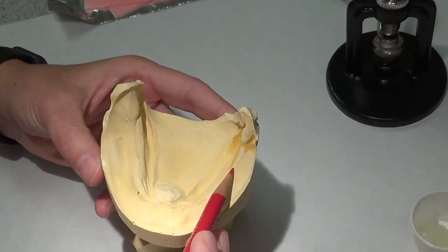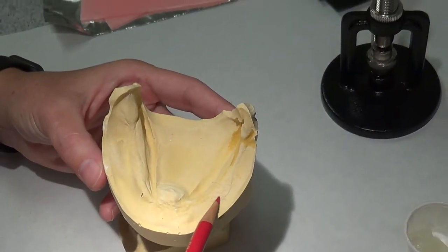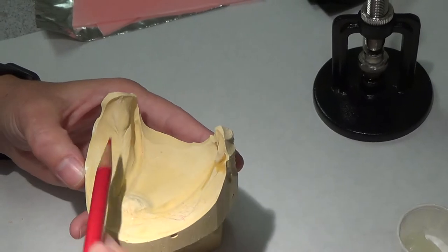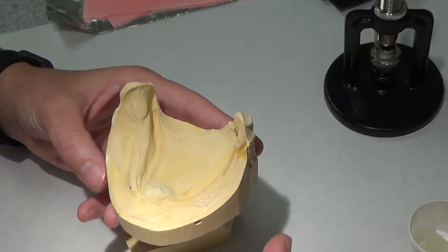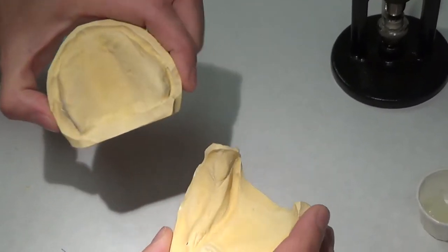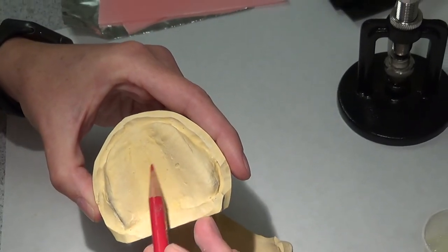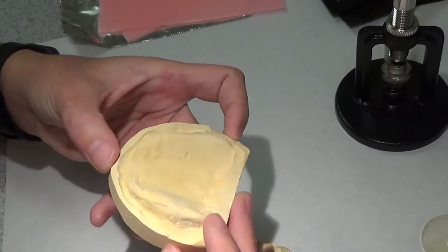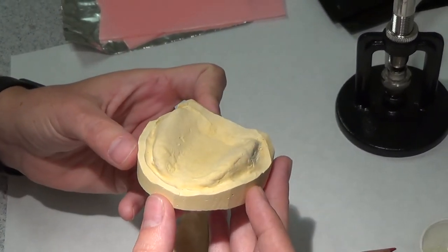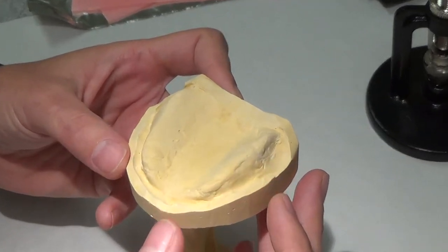I've got support all day because I've got this buccal shelf and I've got the retromolar pads. I've got plenty of support. I've got the palate in the maxilla. It's flat, it's very flat. I've got a ton of support but retention and stability are going to be an issue.